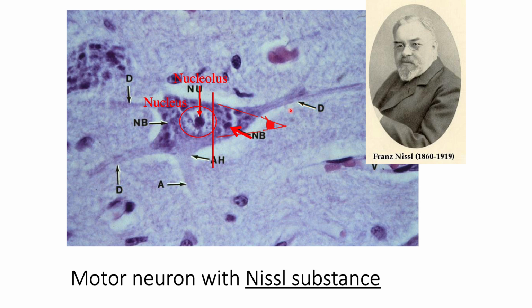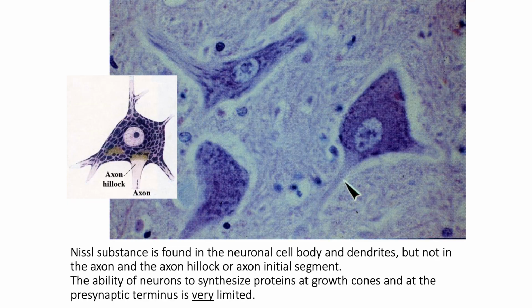Now, you shouldn't mistake a long dendrite to be an axon. Always look at the axon hillock. See whether there are Nissl granules or Nissl bodies present or absent. So the Nissl bodies or granules are named after Franz Nissl, who discovered them. So with this drawing, you can easily appreciate that. Okay, a paler segment, the axon hillock, which continues as the axon. You can always tell how a neuron or nerve cell looks like in a micrograph.